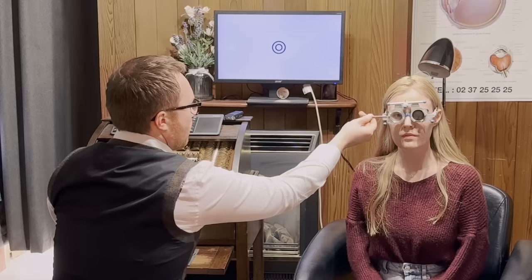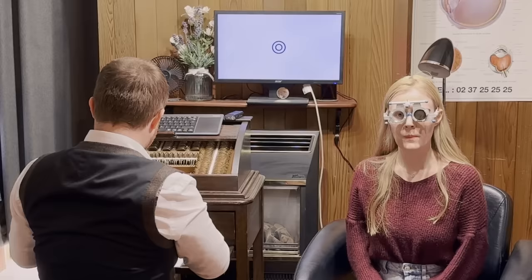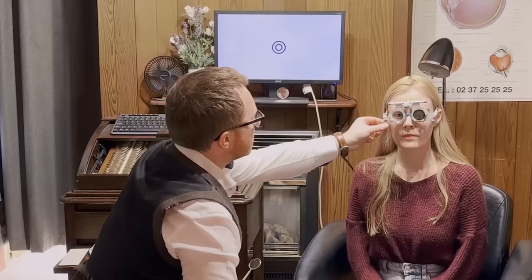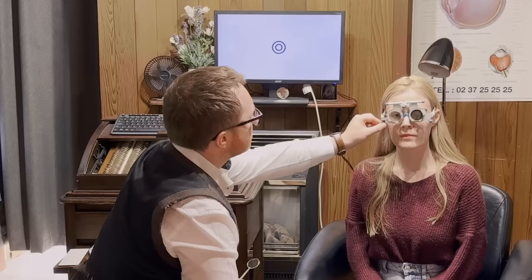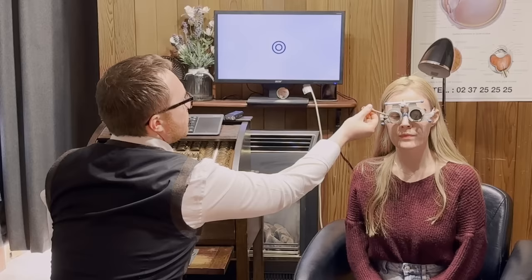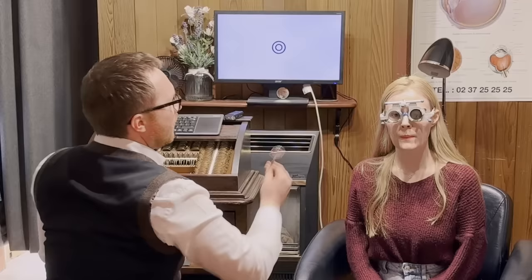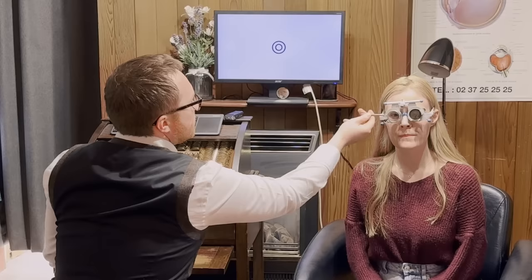And if we do that again, number one, number two, or about the same? Two, I think. Two, yeah. Just going to pop a little lens in. And again, as you're looking at those circles, would you say they're rounder and clearer with number one or number two? One, two, or not much difference? I think number one. Yeah. Number one, number two are about the same. Pretty similar, yeah.